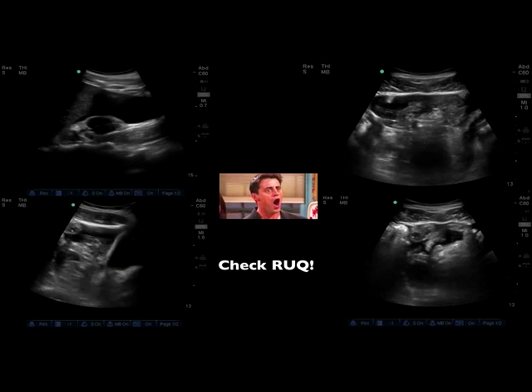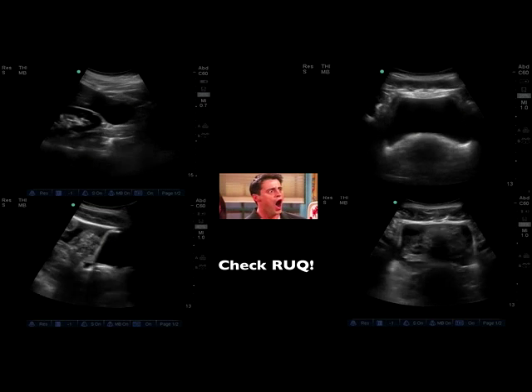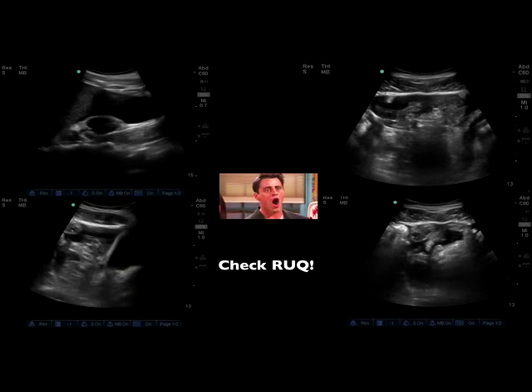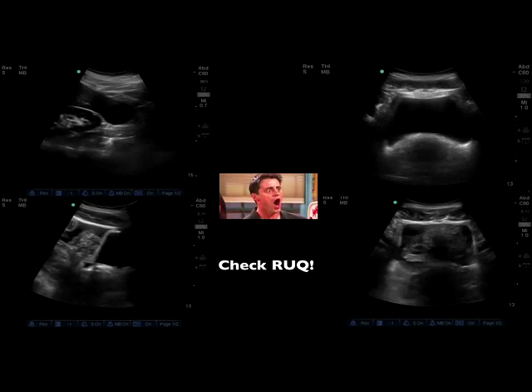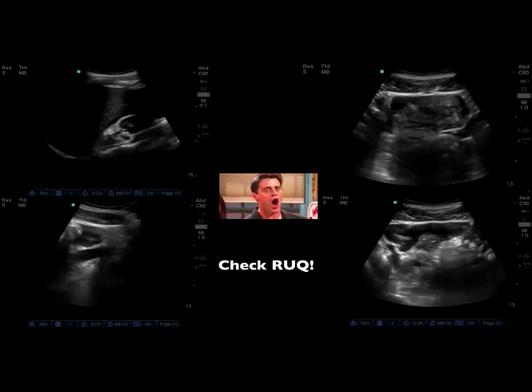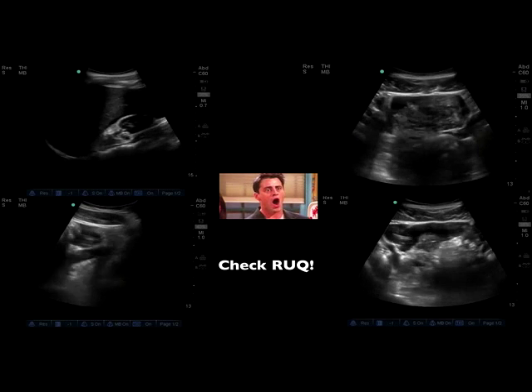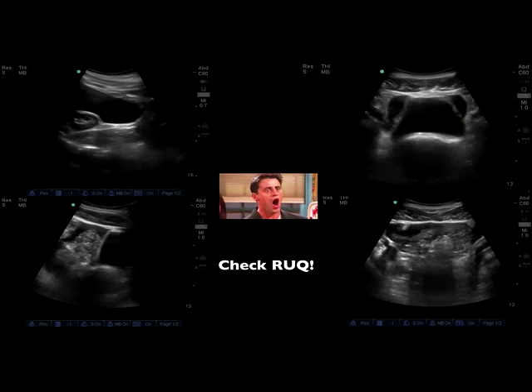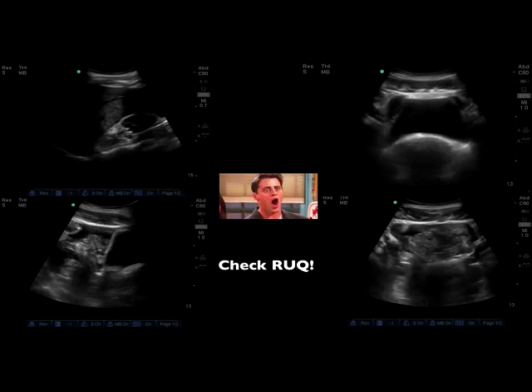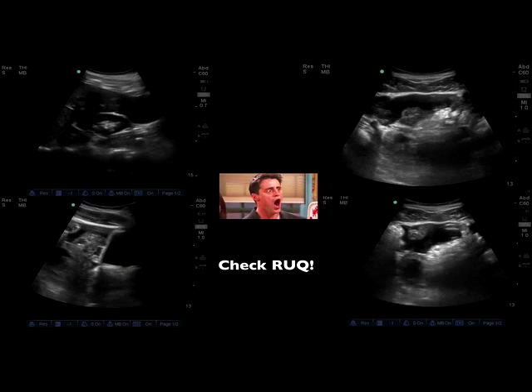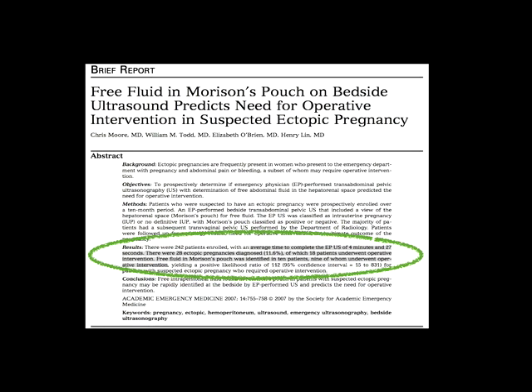This patient has a lot of concerning findings. In addition to free fluid in the pelvis, we can also see free fluid in the right upper quadrant and free fluid surrounding the small bowel as well. It's very important if you have a patient where you're concerned about ectopic pregnancy that you check the right upper quadrant view of the FAST scan. This was evaluated by Chris Moore, who found that free fluid in the right upper quadrant or Morrison's pouch is predictive of needing operative intervention for ectopic pregnancy.